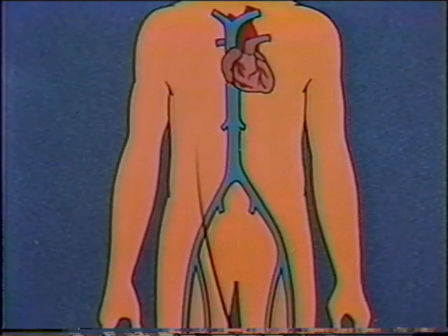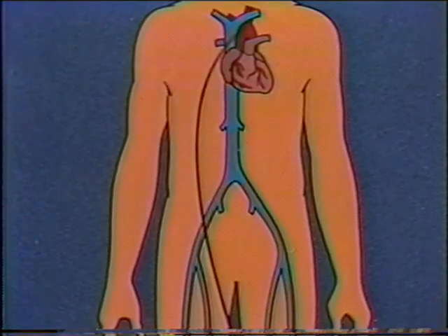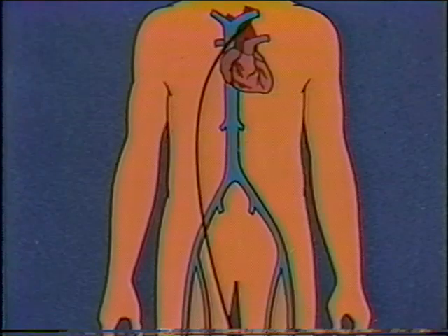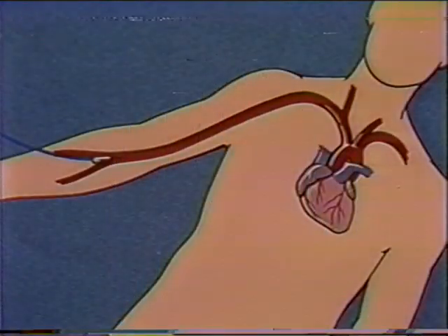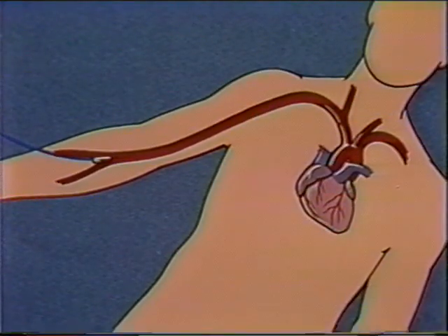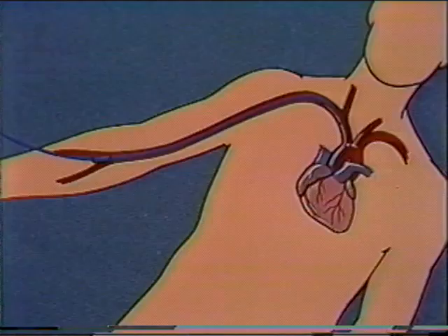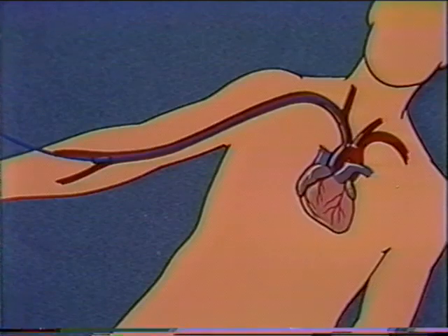Your cardiologist will follow the movement of the catheter to your heart with an X-ray machine known as a fluoroscope. The movement of the catheter will appear on a television screen to permit him to follow it to your heart. When the catheter reaches your heart, dye will be injected into each of your coronary arteries through the catheter. Moving X-ray pictures will be taken that show the dye flowing through your coronary arteries. These X-rays will allow your cardiologist to see if your coronary arteries are narrowed, blocked, or normal.